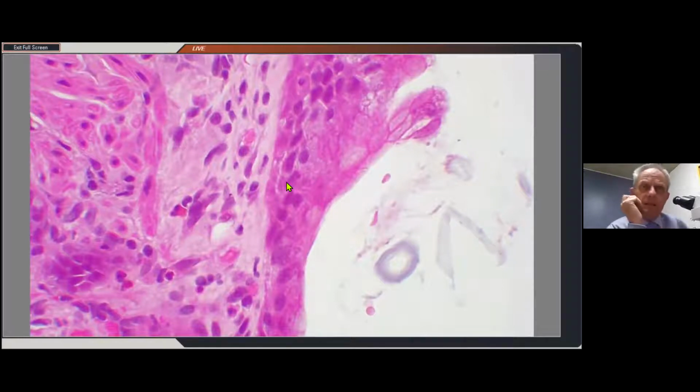And what happens there is that the endocervical epithelium, on the surface, undergoes metaplastic change and becomes squamous in type. And then in many instances, you get a squamous epithelium overlying columnar epithelium, the columnar mucosa of the endocervix. The multi-layered epithelium in Barrett's esophagus is very similar. In fact, multi-layered epithelium is quite characteristic of Barrett's esophagus, and it helps you confirm the diagnosis. And here, there is just a focus of that.